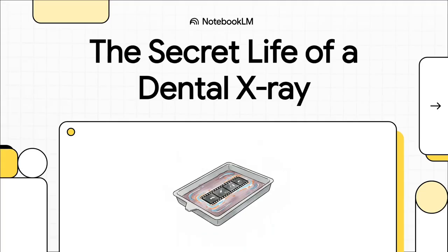Have you ever sat in that dental chair, had that little piece of plastic put in your mouth, and then, like a minute later, the dentist is looking at a perfect map of your teeth? It feels like magic, right? But it's actually this super fascinating chemical journey. So today, let's pull back the curtain and uncover the secret life of a traditional dental X-ray film.